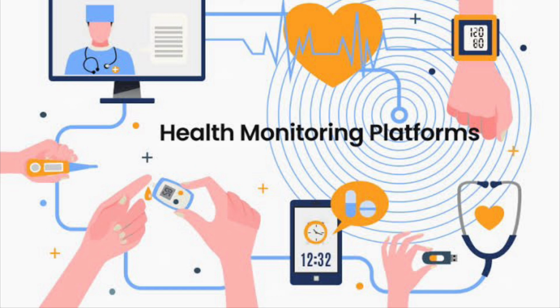Now, the merit of having continuous vital signs monitoring is naturally that the nurse need not go frequently into the room. It can be monitored. There is a feeling of the patient being monitored continuously. Many times that can lead to a false sense of assurance that everything is perfectly fine. So that is why having a command center to very accurately monitor the data, go through the false alarms and address the correct alarms, is needed. Only then does this wearable continuous monitoring technology, whether for continuous inpatient monitoring in the hospital setting or for remote monitoring in a care home, from the residence or from the patient's home, become useful in clinical practice.